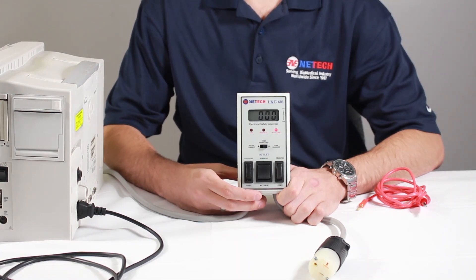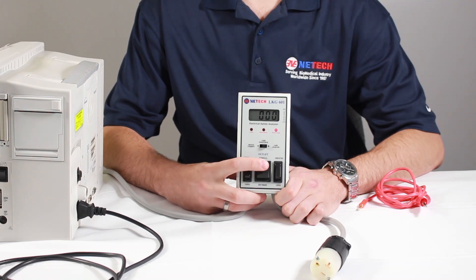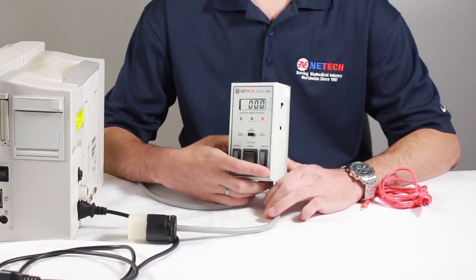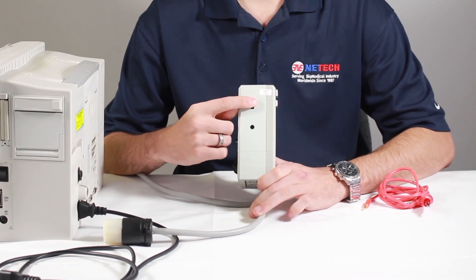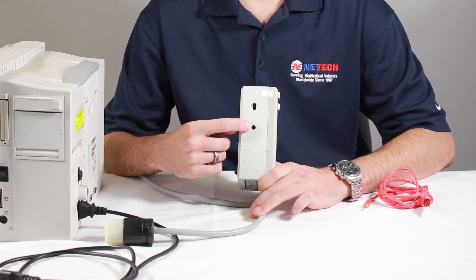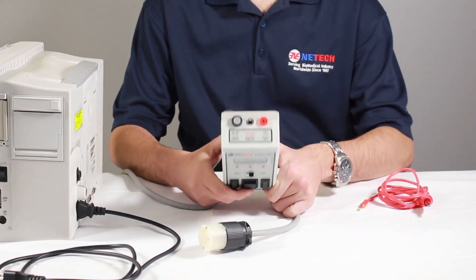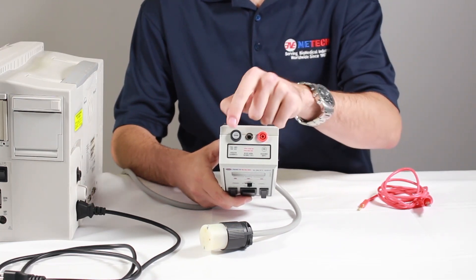Below the three-position slide switch, you'll find the open neutral switch, the polarity switch, and the open ground switch. On the right-hand side of the device, you'll find a load selector switch, allowing you to change between IEC601-1 and AAMI international standards. You will also notice the recessed zero adjustment that allows zeroing of the display to eliminate test cable resistance variations. At the top of the device, you'll find a red case ground, a test jack, and the fuse.